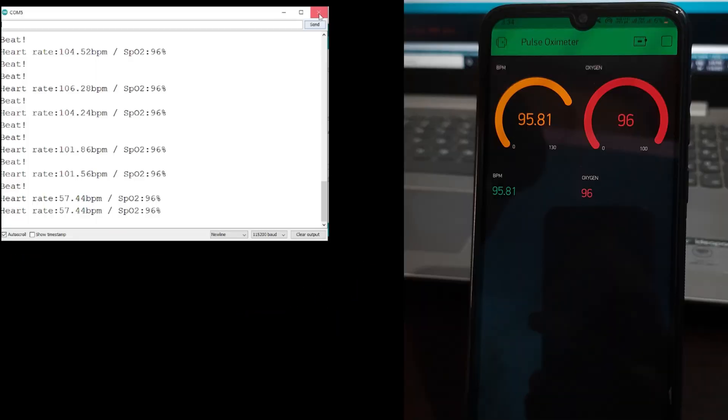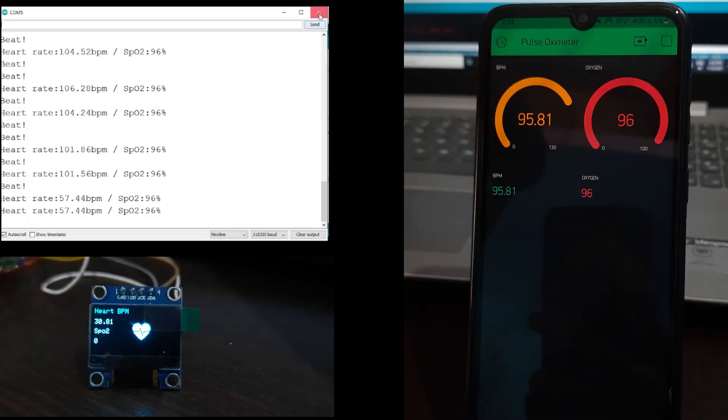We will divide this project into three main parts. Step one is displaying the output in the serial monitor. Step two is displaying the output in the OLED display, and step three is displaying the output in the Blynk application.